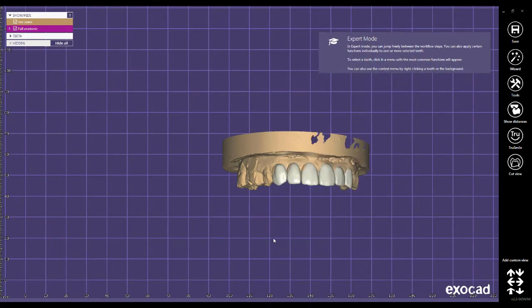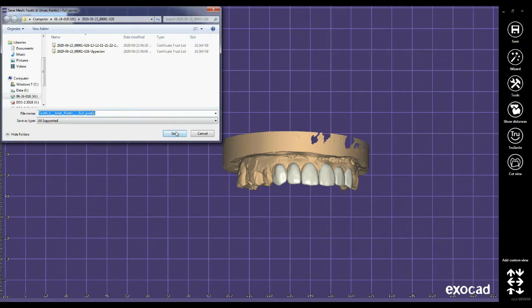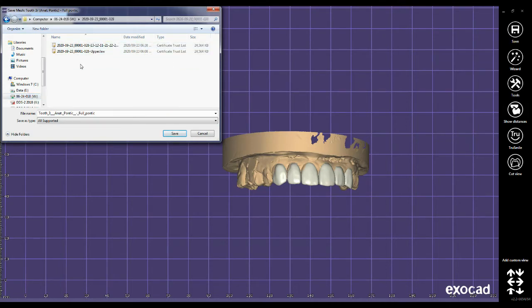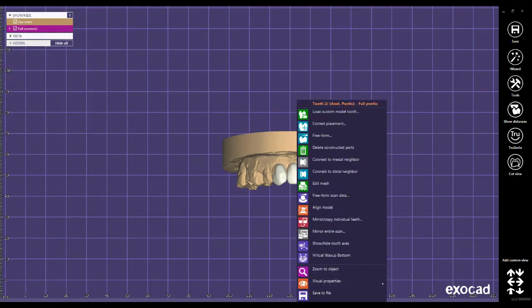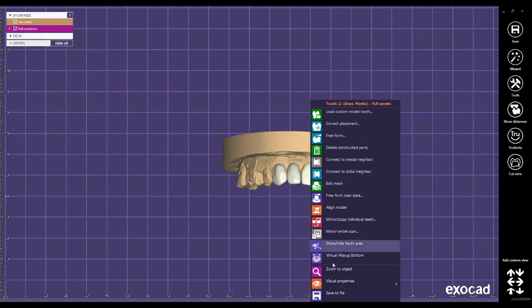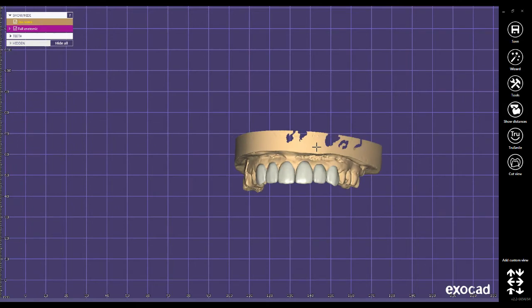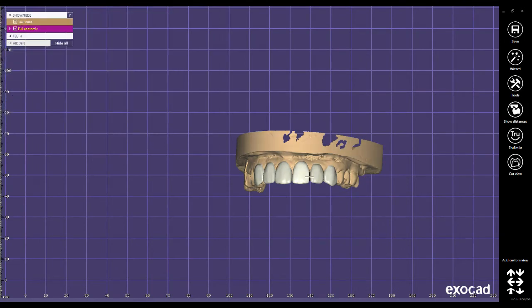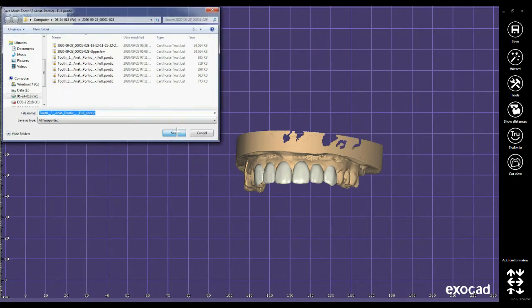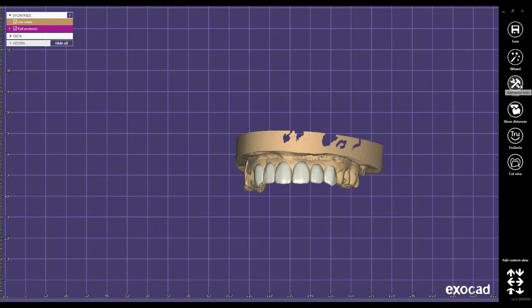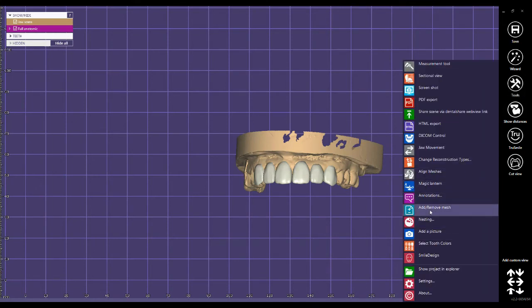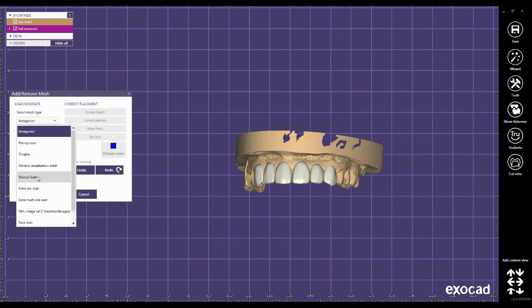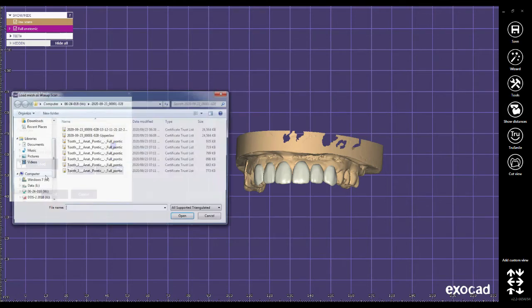By right mouse click, I need to save every single tooth. Choose the destination as you wish and save them one by one. In the right tab, click on tools and then add or remove mesh. Select mesh type wax-up scan and load.